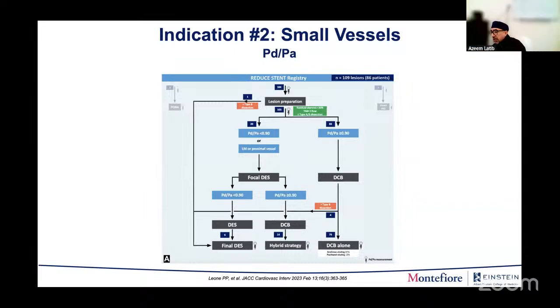Yeah, I agree. Mark has to leave, and I just want to answer his question quickly in the chat. He asked, when you do a 1-to-1 ratio, you assume your size into the distal part of the lesion. Yes, I agree. Why the reluctance to use DCB? It's not that I'm reluctant, Mark. I'm completely okay with using rota before DCB. Here's my concern: how effective are DCBs in calcified lesions? That's really where I'm concerned.